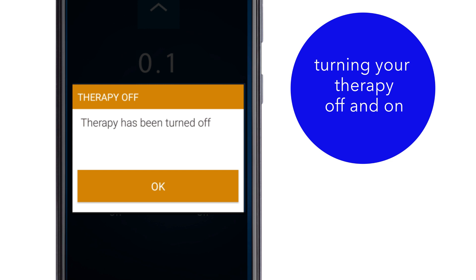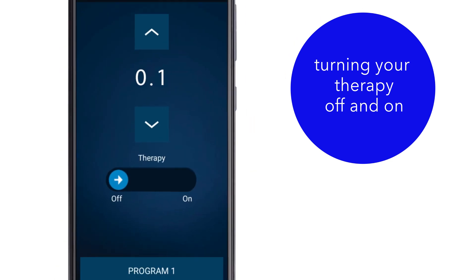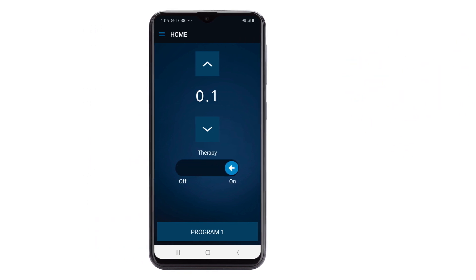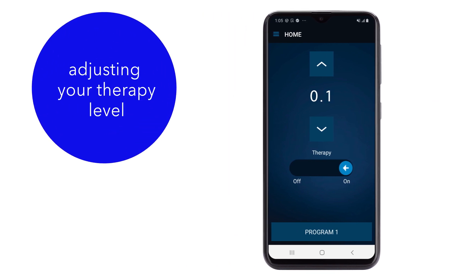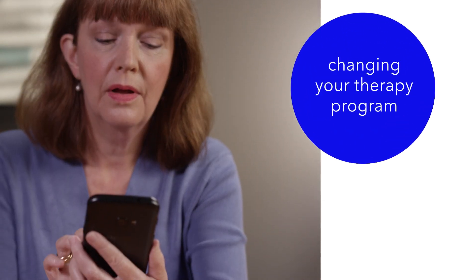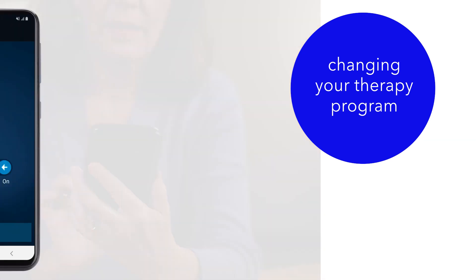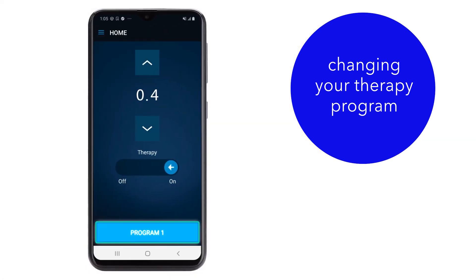The therapy off notification appears. Tap OK. Your therapy remains off until you turn it back on. Slide the arrow to the right to turn therapy on. Use the up and down arrows to adjust the stimulation. If your healthcare provider asks you to make a program change, follow these simple steps. Tap the Program button at the bottom of your screen.